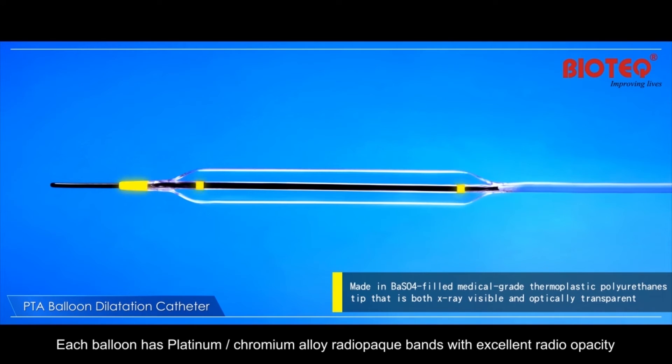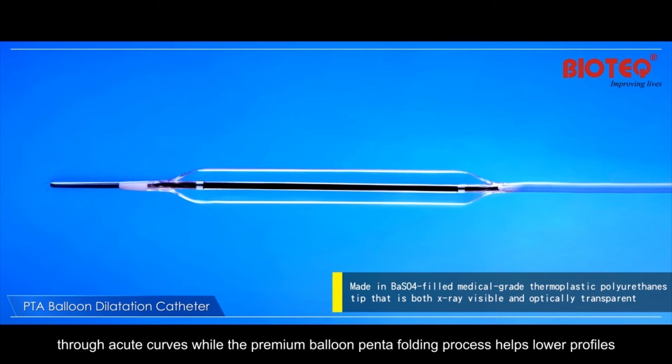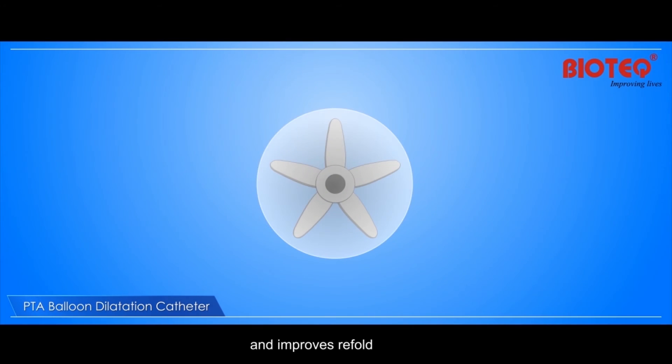Each balloon has platinum-chromium alloy radiopack bands with excellent radio opacity. A taper balloon tip design ensures smooth transition between the guidewire and balloon tip, enabling passage through acute curves, while the premium balloon pentafolding process helps lower profiles and improves refold.